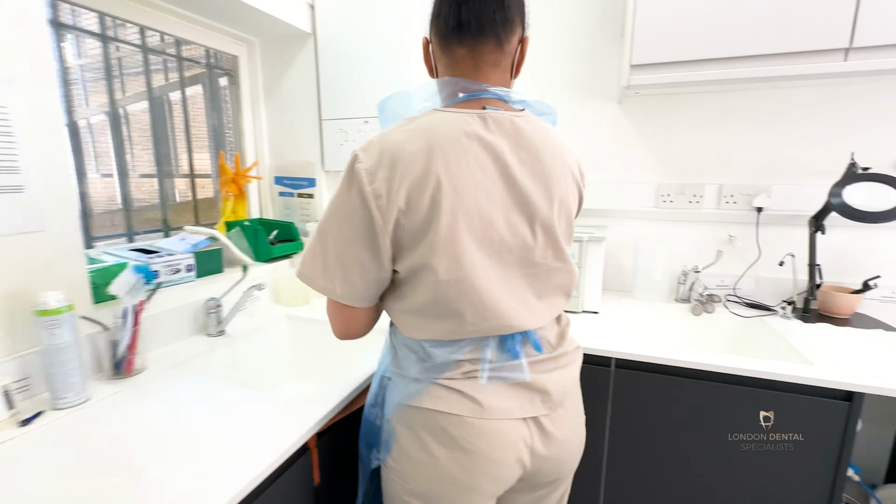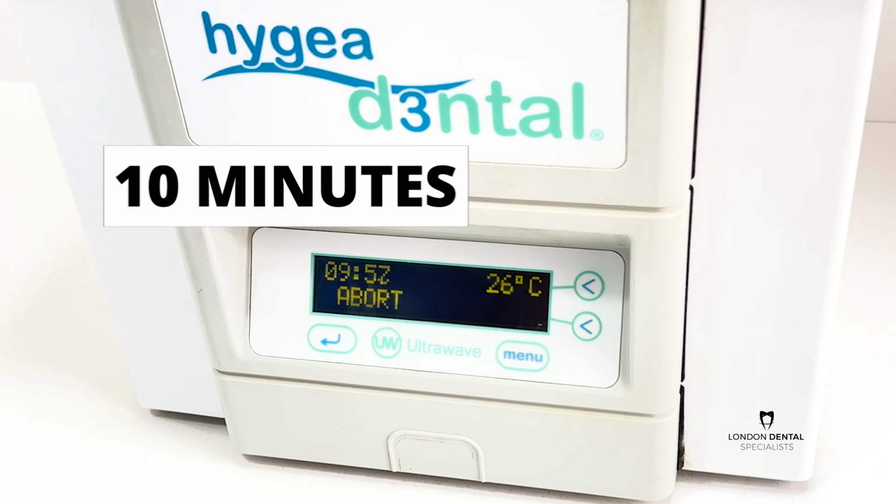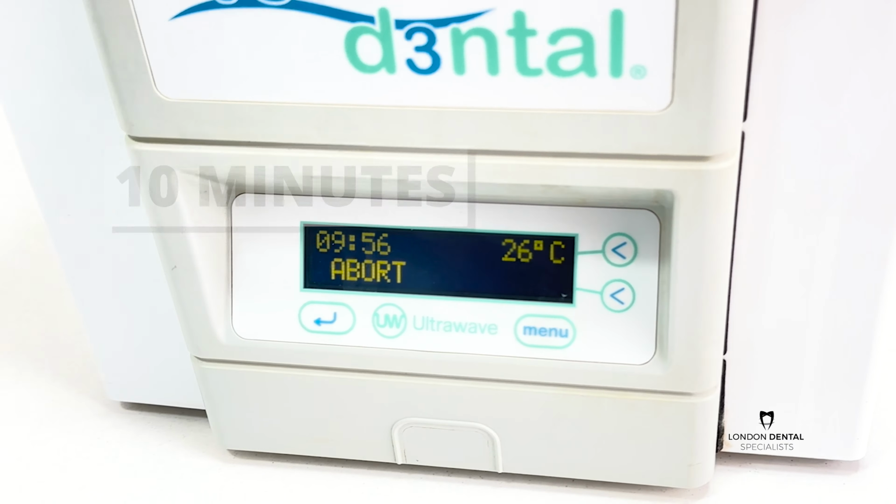Because we are using the dental dishwasher and it has to be submerged, it stays in that dental dishwasher for 10 minutes. Some of you at home are used to cleaning your dishes perhaps before you put them in the dishwasher, and in a dental sense, that's what this thing is for. But to try and also keep ourselves safe, we put the instrument straight into the dishwasher. I keep calling it dishwasher because that's what you'll be familiar with, but it's an ultrasound bath. We're going to leave that in there and then show you what we do next.